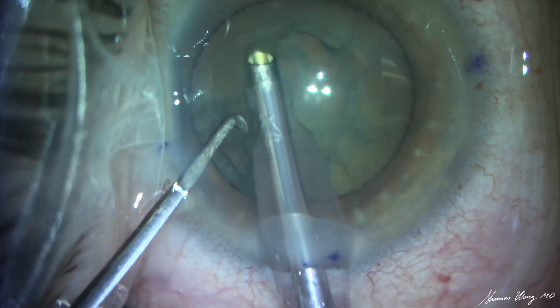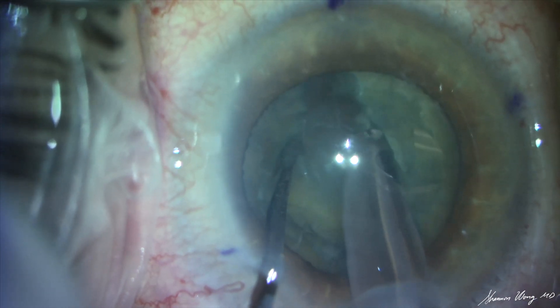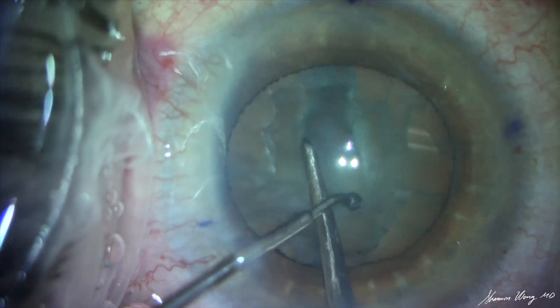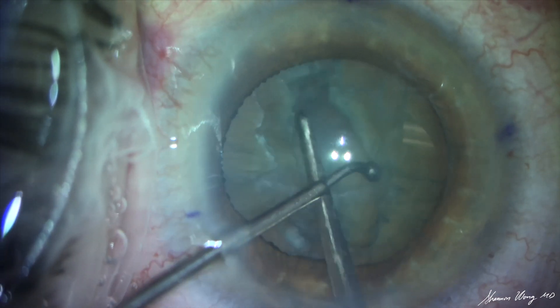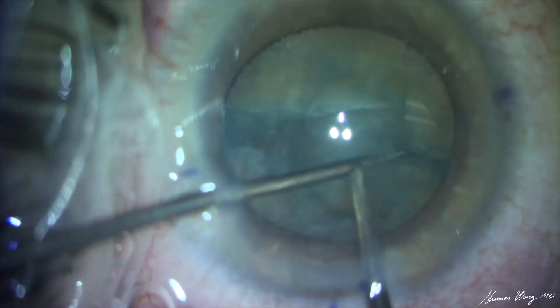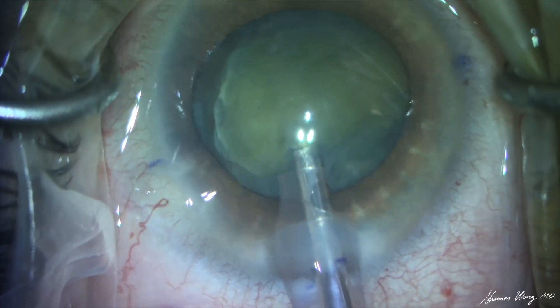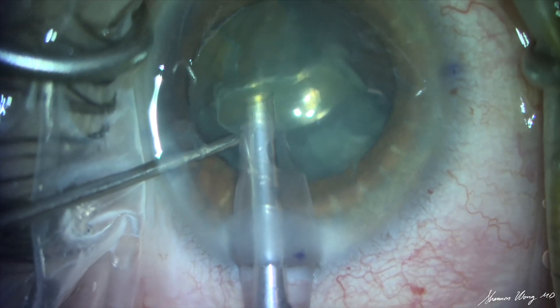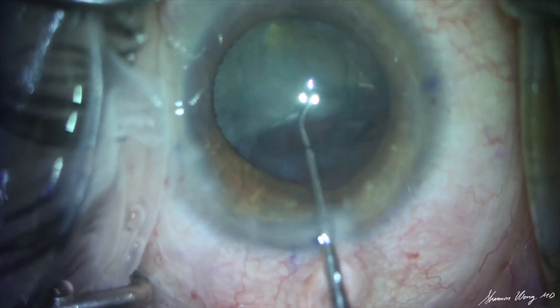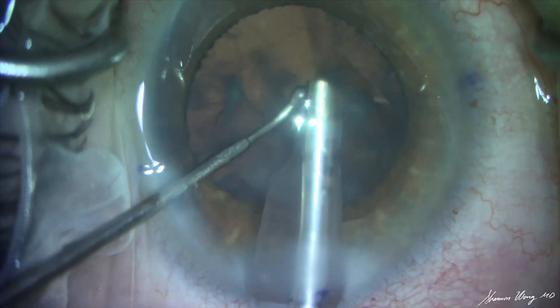We begin phacoemulsification of the cataract. In order to minimize placing excessive stress on the zonules, after creating the initial groove, viscoelastic is used to fill the anterior chamber. Instruments are then used to crack and gently rotate the lens in a bimanual fashion. We mobilize the first half of the nucleus, bring it out of the bag, and emulsify it. The second half is then mobilized and emulsified in a similar manner.